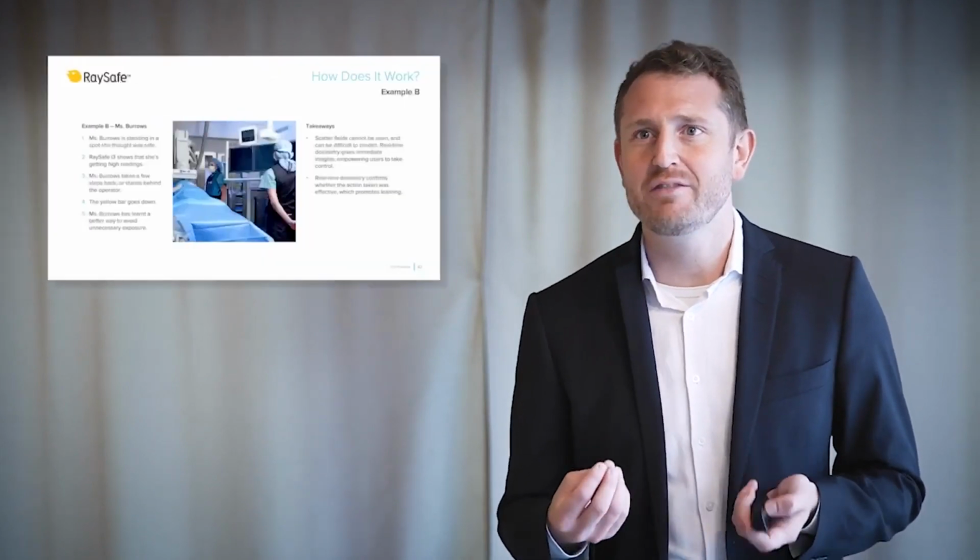Miss Ranger alerts Dr. Smith that her bar is red. Dr. Smith positions the shield properly, and the next pedal press, the bar is much lower. Real-time dosimetry reminds users to use their existing tools and knowledge, for example, room shields. And real-time dosimetry encourages teamwork and helps build a radiation safety culture.